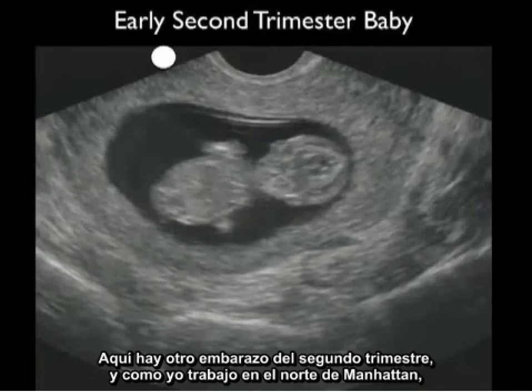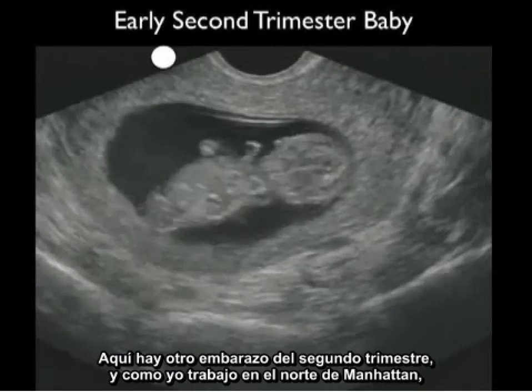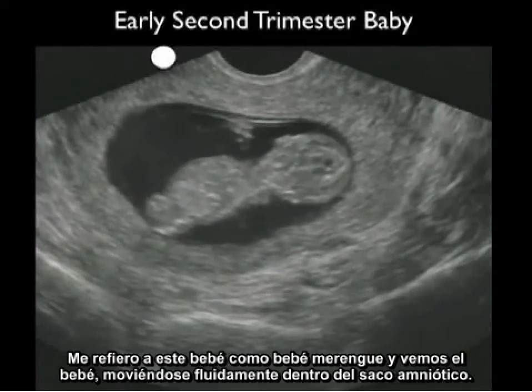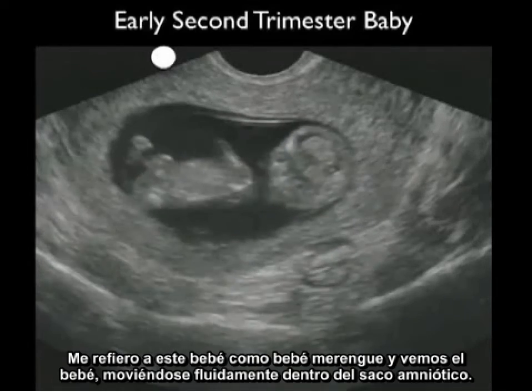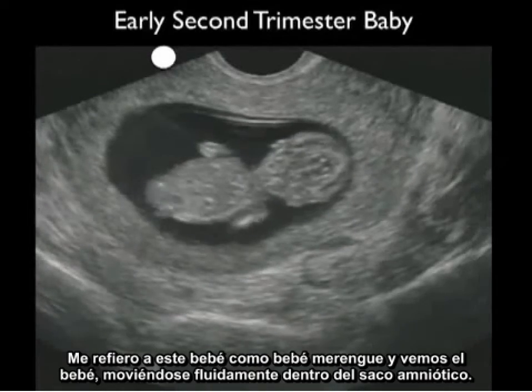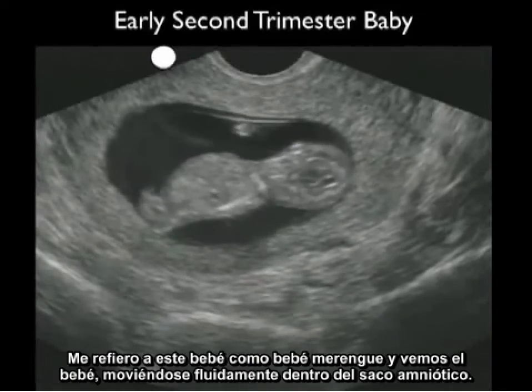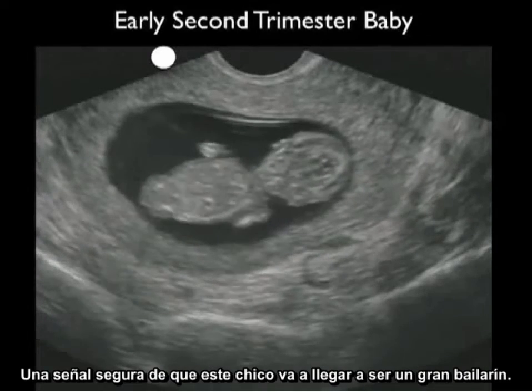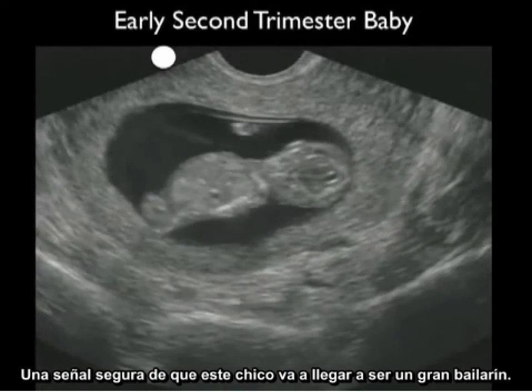Here's another second trimester baby — working in northern Manhattan, I refer to this as the merengue baby. Note the baby moving around fluidly within the amniotic sac, a sure sign this kid will grow up to be a slick dancer.